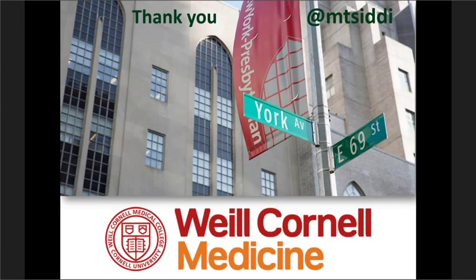What type of transport media do you have on your ROSE cart? What do you do for culture and flow submission? For RPMI, we do have access to a fridge in the area. If not, and it is suspected that there would be a lymphoma workup, we take it with us downstairs to the GI suite. So for lymphoma workup, RPMI, depending on the situation, we will take it with us. For microbiology, we just collect fresh and submit it directly. If you don't want to do that, you can put it in saline.